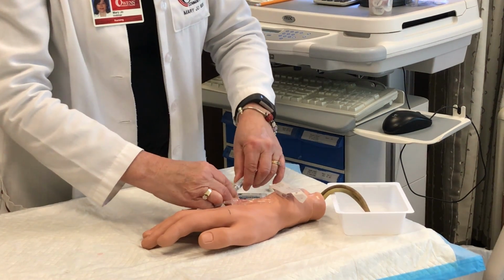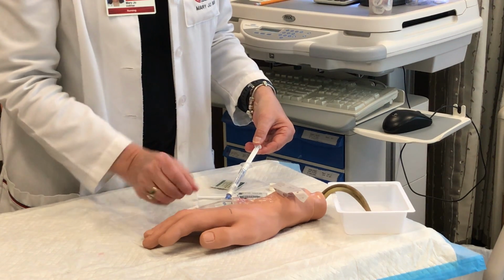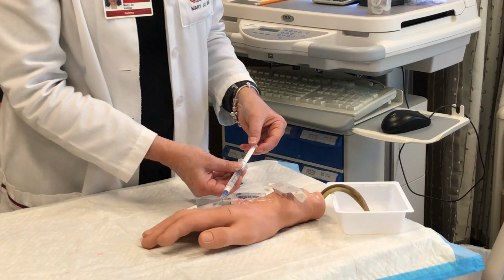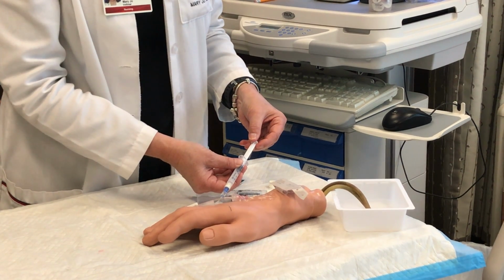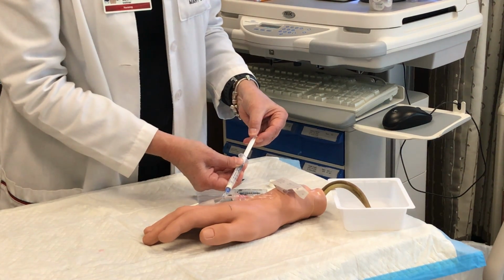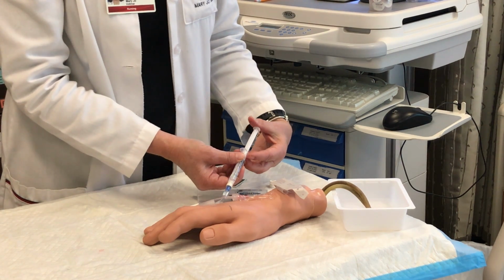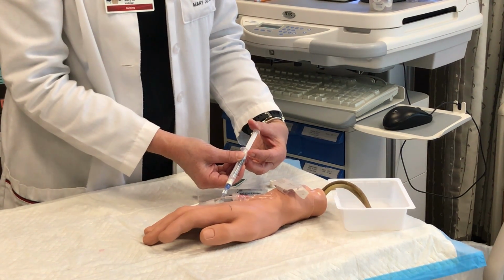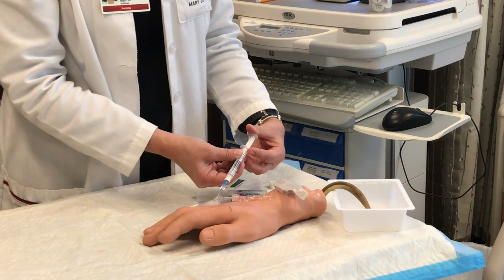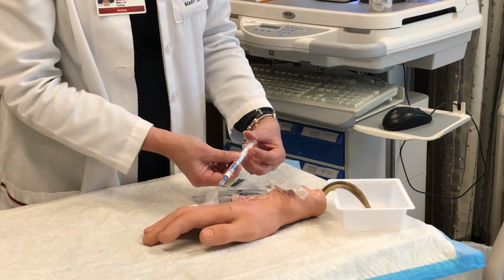Attach normal saline flush syringe into INT port. Release clamp if present. Pull back gently on plunger of syringe and check for blood return. Slowly flush the INT with the normal saline, observing the site for infiltration and ease of flushing. Remove syringe. I'm going to pull back on my saline, and I'm noting here if there's a blood return. Once I see that flashback of blood, I'm going to slowly push that saline, the 2.5 mLs, and I'm noting the ease of flushing. Am I meeting any resistance?